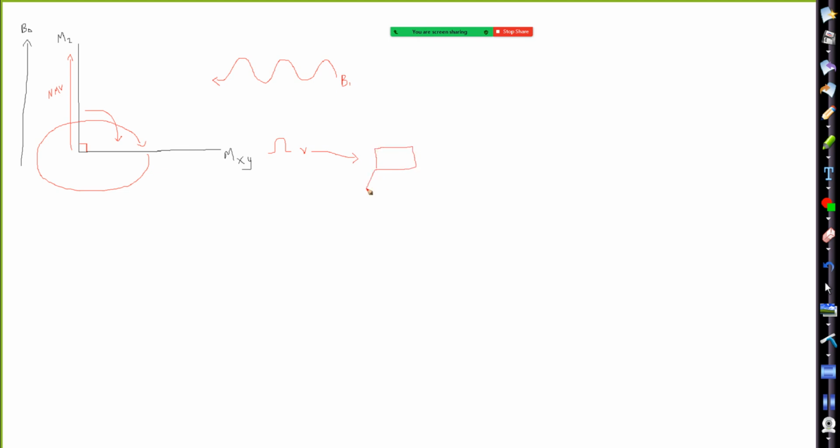I'm going to draw a little computer over here. All right. And ultimately we get our image. But we have to do one more thing, and we have to do it a lot of times because these pulse sequences require repetitive excitation pulses and then letting the tissues relax and then constantly doing that over and over again.